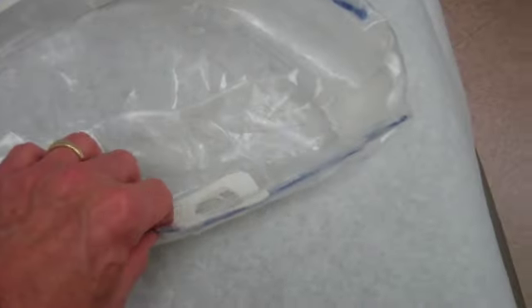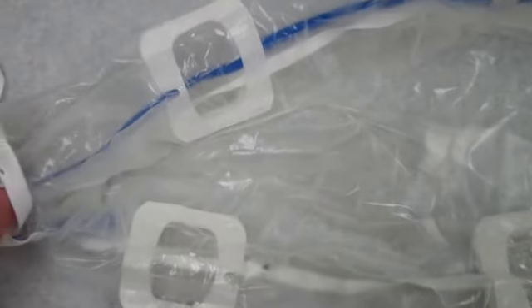Now, the first thing you can see is that the bag will stay open nicely. And that's beautiful. So it goes inside and stays open. And then when you're ready to come out, basically what you do is you just pull the railing. You pull the railing here and it slides out of the bag. You pull it through the laparoscope, right through here. Comes out nicely. And then you just pull it through the trocar. Then pull the other side and then the bag just closes right up and then you've got your bag. And so those are the changes. So everything's contained. You can put some sutures through these if you want to. They're pretty sturdy.